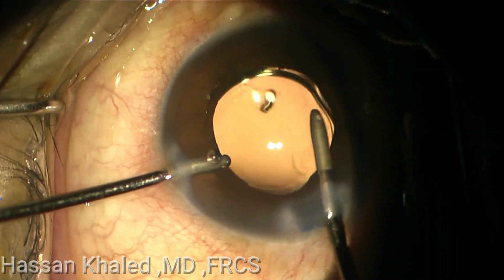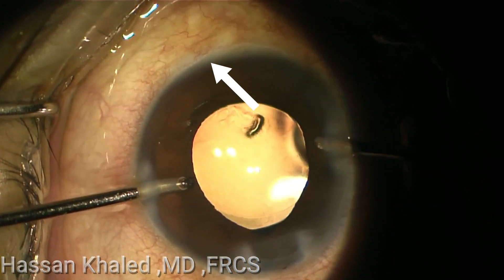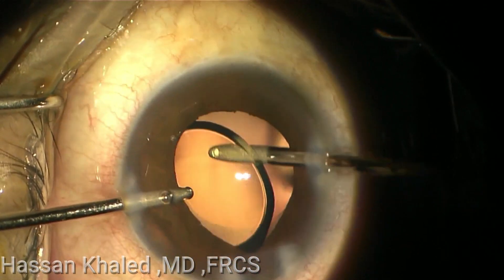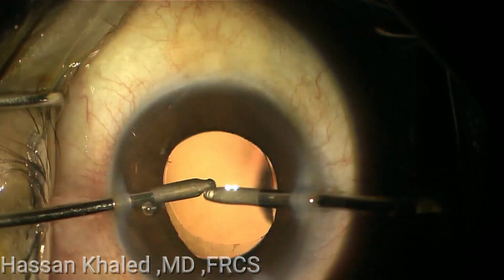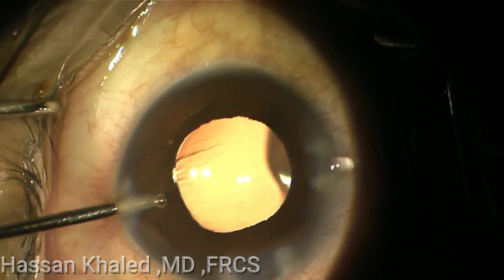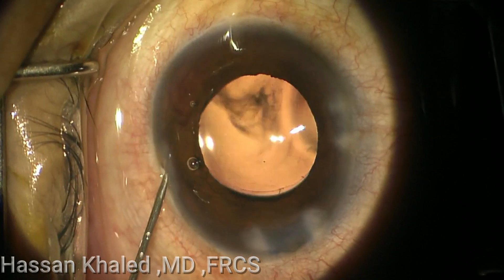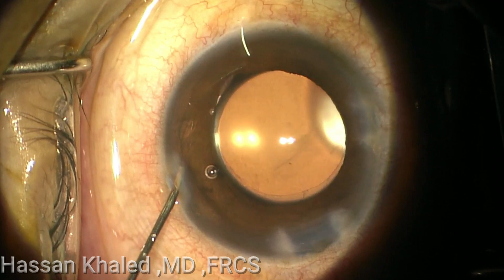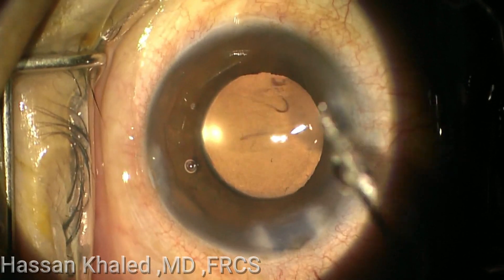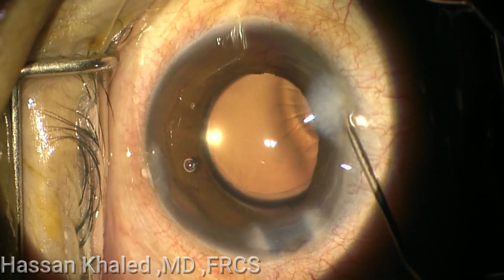Now watch carefully while washing the OVD. I go through the main incision slightly into the anterior chamber angle. At this step, I make a minor trauma into the angle. Then I complete washing the OVD from the anterior chamber and behind the IOL. And now while doing gentle irrigation inside the anterior chamber, you can see the bleeding into the anterior chamber from the same side that I made the trauma.